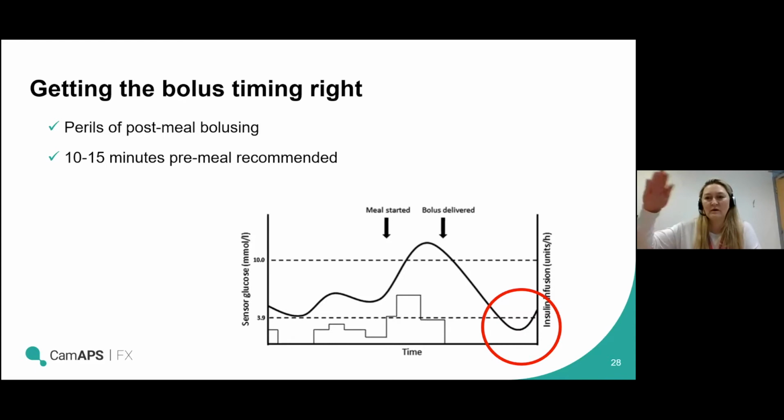You get this more up and down pattern, whereas if the system's constantly delivering something, never backing off to nothing, then everything's much smoother, and you seem to avoid, again, topping out above that 7.8 higher end of the target.